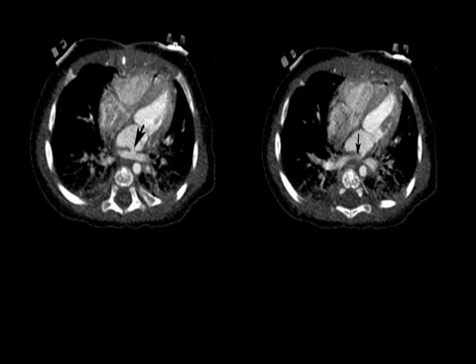Again, this was a child that had a dual source scan, post-op anomalous venous repair, and that's when the veins don't drain when they're supposed to, so the surgeons just hook them up to the right chamber. So the right chamber is the left atrium right here, CT angiography, and here's where they come in. But you can see a stenosis right there, the confluence of the pulmonary veins, and a stenosis right there.